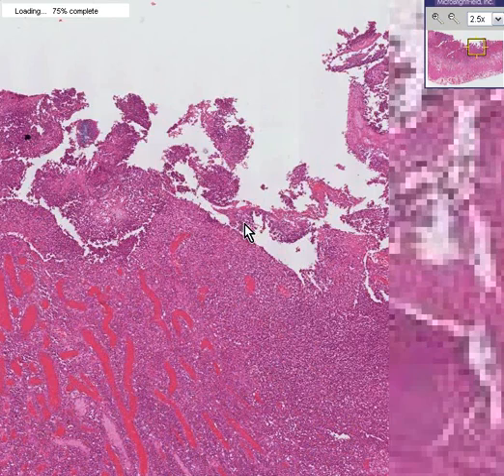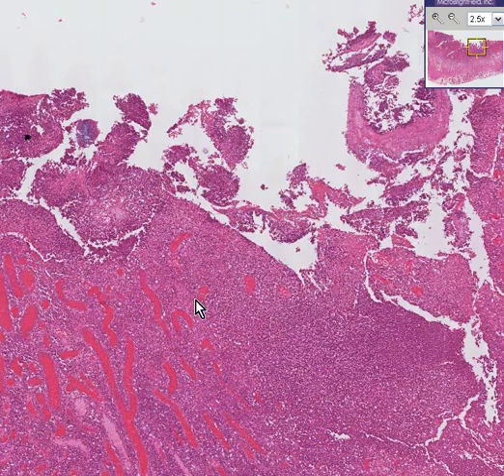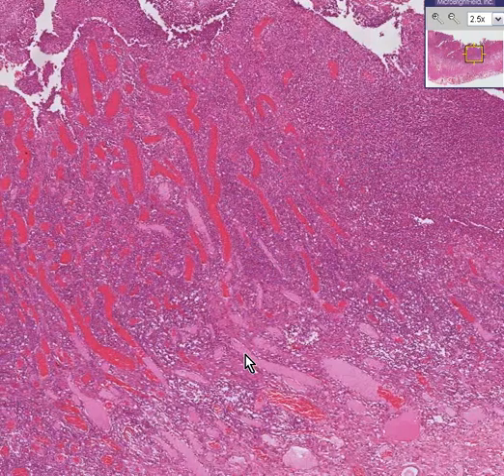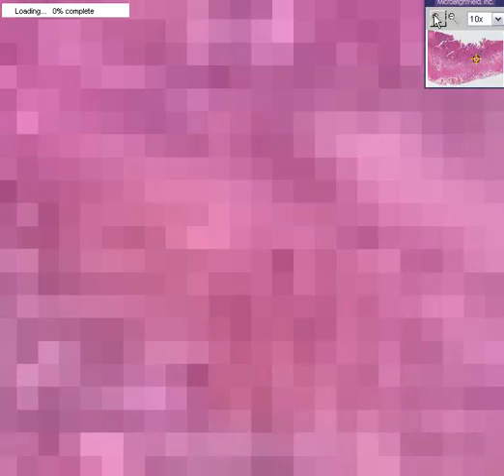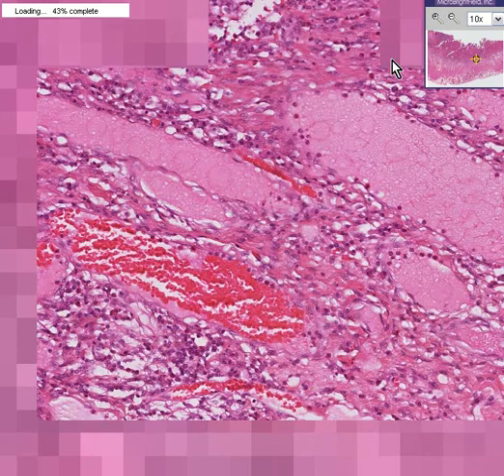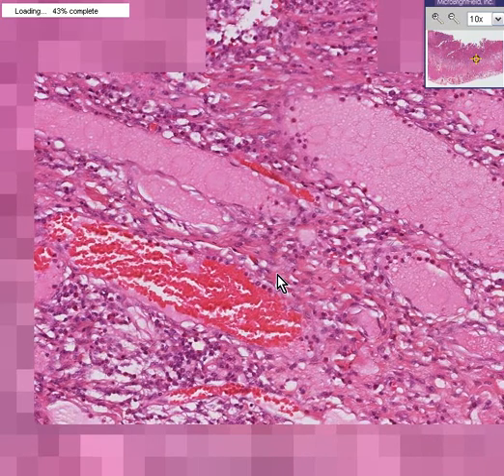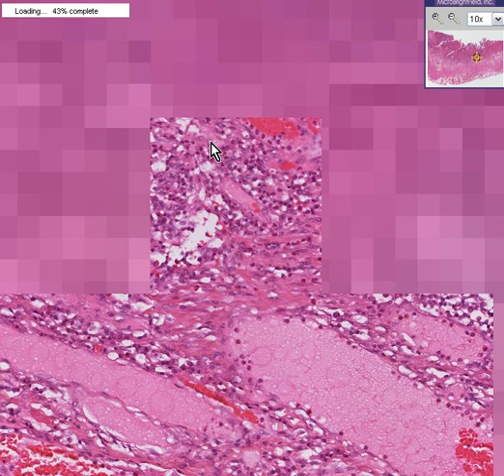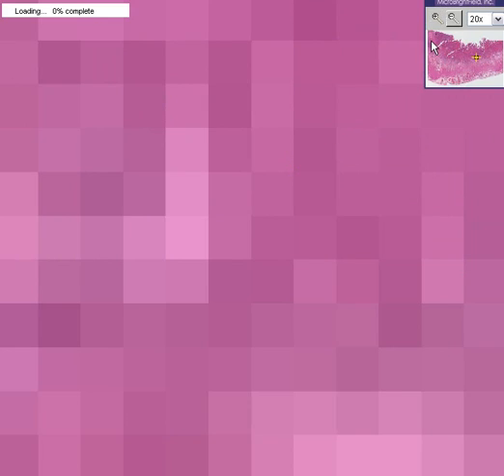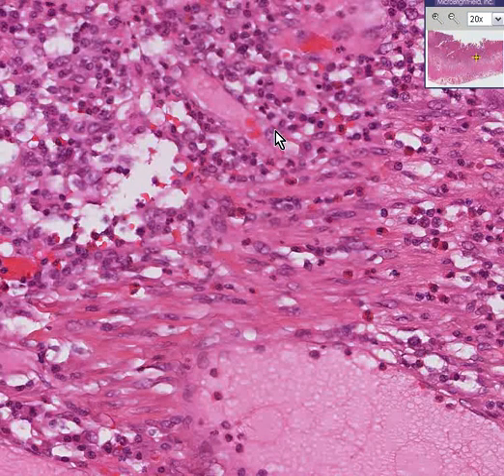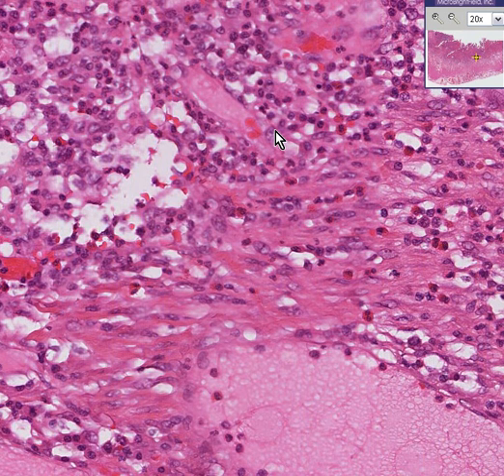Also notice that the mucosa here is ulcerated and entirely absent in this area. The cells of inflammation seen throughout all areas are different kinds of cells — they're neutrophils, lymphocytes, and histiocytes. Depending on how acute or chronic the disease is clinically and pathologically, you'll see some more than others.